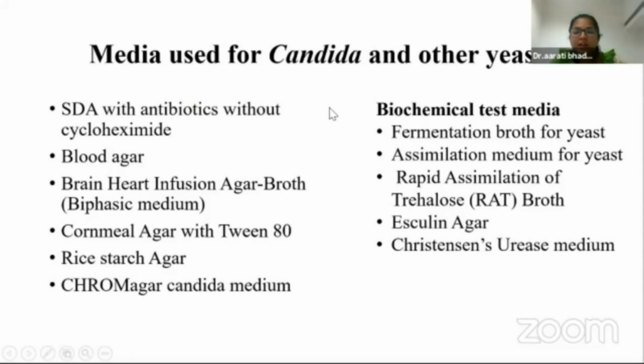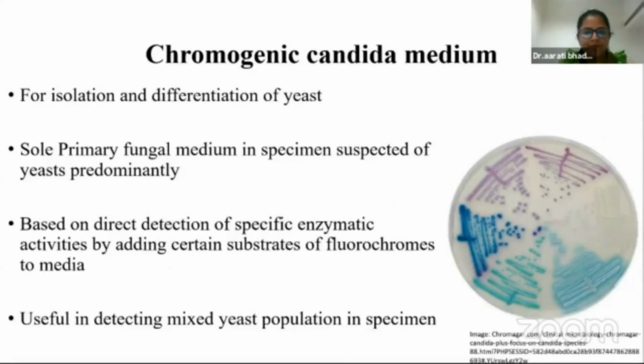We can use another biochemical test media also. So these are fermentation broth for yeast, assimilation medium for yeast, rapid assimilation of Trehalose broth, esculin agar, and Christensen's urease medium. So I will be covering one by one.